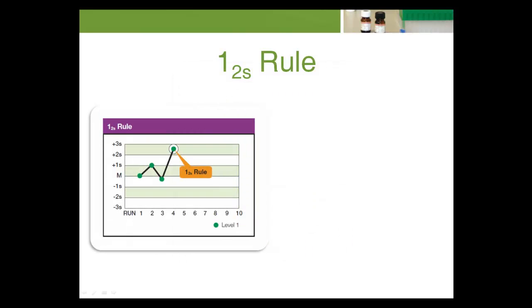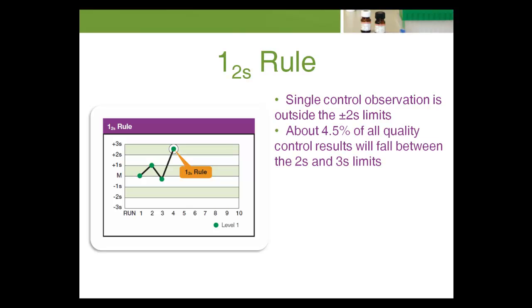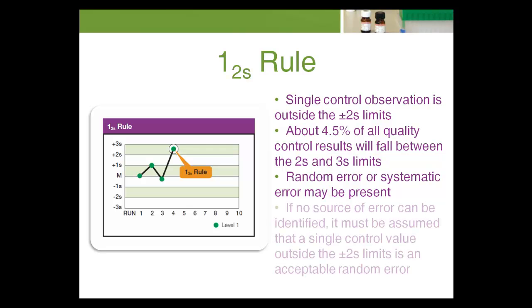The 1-2s rule is a warning rule that's violated when a single control observation is outside the positive-negative 2s limits. Remember that in the absence of added analytical error, about 4.5% of all quality control results will fall between the 2s and 3s limits. This rule merely warns that random error or systematic error may be present in the test system. The relationship between this value and other control results within the current and previous analytical runs must be examined. If no relationship can be found and no source of error can be identified, it must be assumed that a single control value outside the positive-negative 2s limits is an acceptable random error. Patient results can be reported.